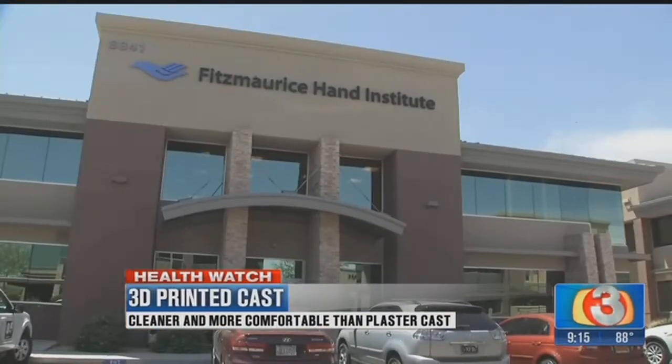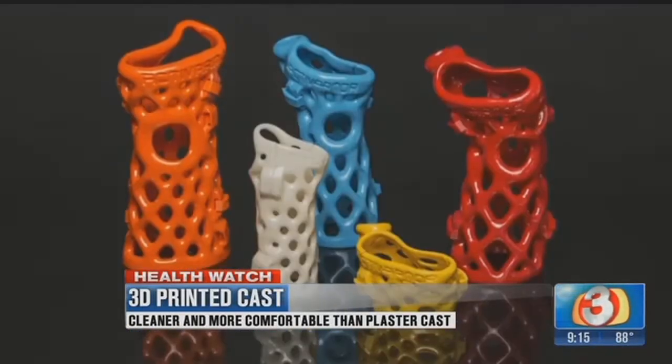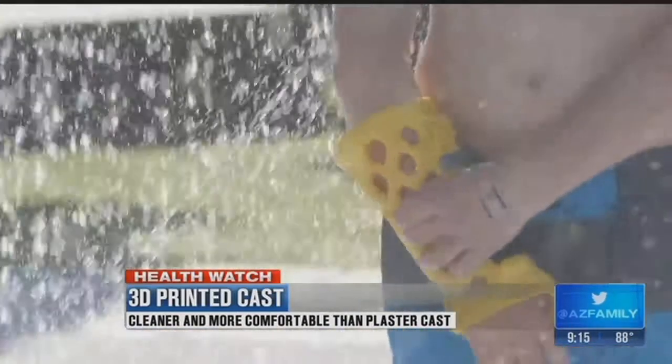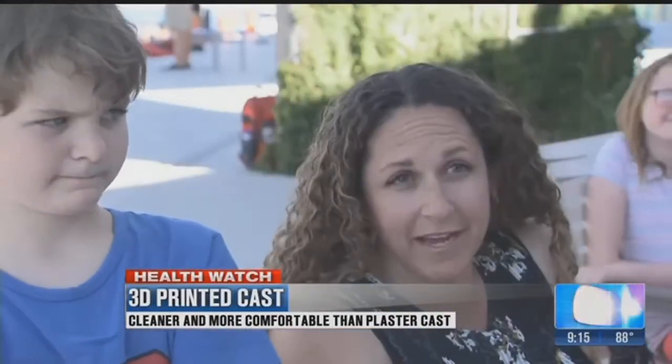Fitzmorris Hand Institute is the only place in Arizona where you can be fitted for the device. They took a 3D image of his wrist and designed this piece just for him. In a few days the printed cast is returned and ready to wear. It's lightweight — they told me it was made of the same material that a Lego is made out of.